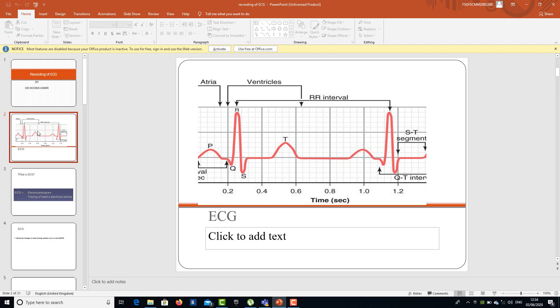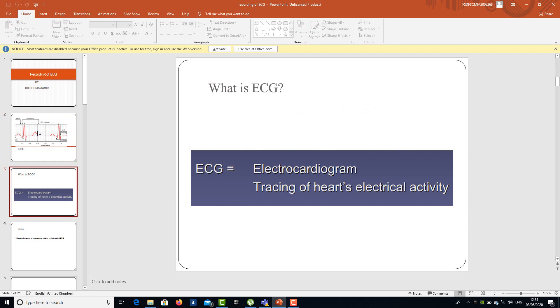This is a normal ECG showing different waves which are upwards, different waves which are downwards, different intervals, and different areas. These actually have some meaning — they are showing the contraction or relaxation of different areas of the heart. ECG is the derivative of electrocardiogram, which shows us the tracing of the heart's electrical activity.